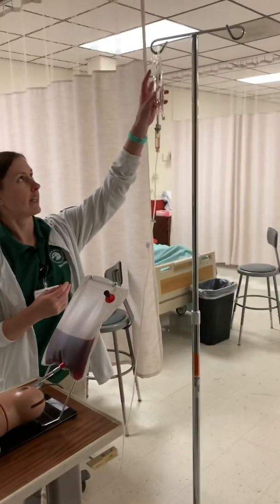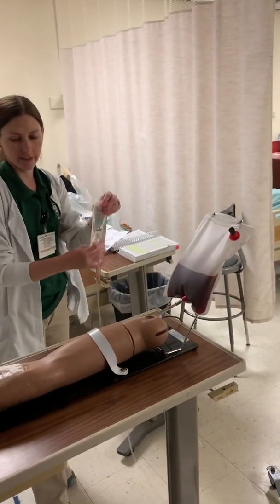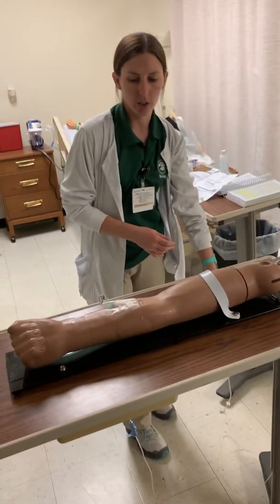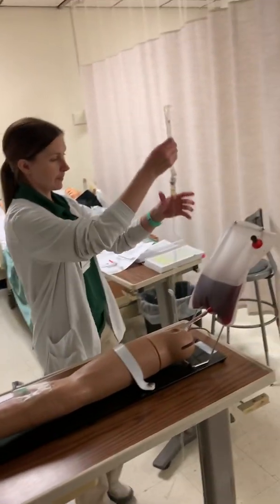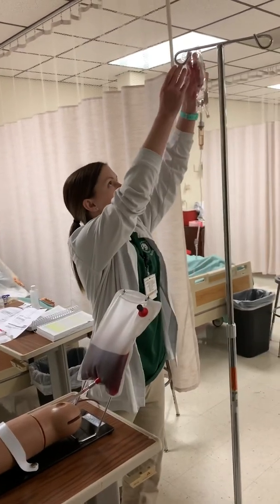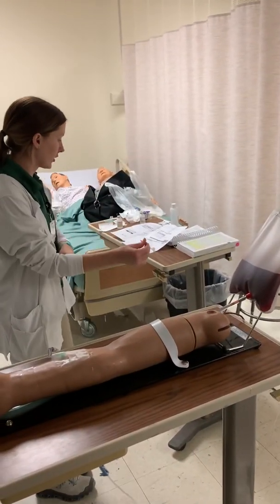And then I want to check for patency, so I want to lower the bag of fluids below the level of the arm and check for blood return. And there's blood return, so the IV is patent. All right, and now we are ready to start giving our medication.